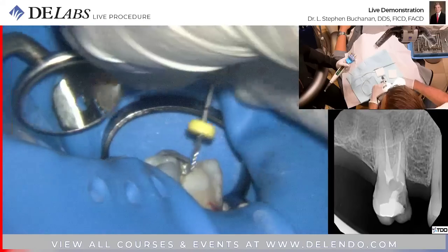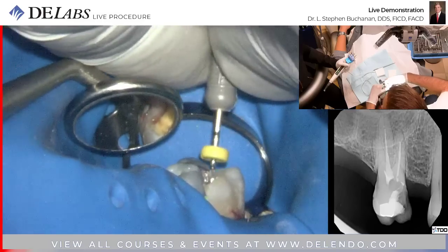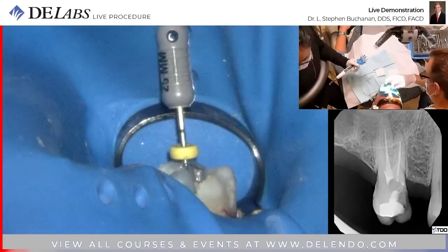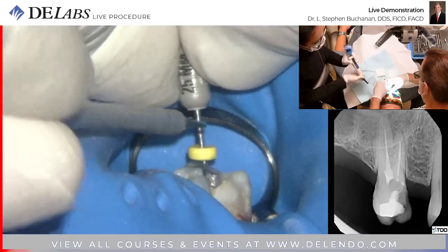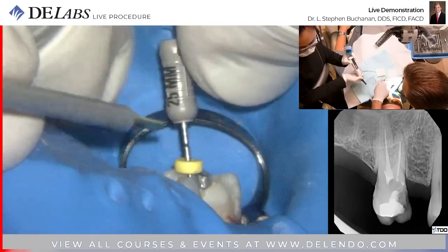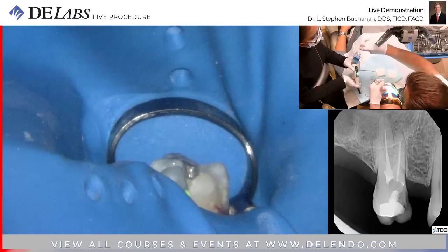Here's the MB2. Yeah, I think it merges with the MB1. Okay, let's get a length here just for yucks. And which canal is that, Doctor? This is the MB2, by the palatal cusp tip. I need a bigger file. Take a 10.